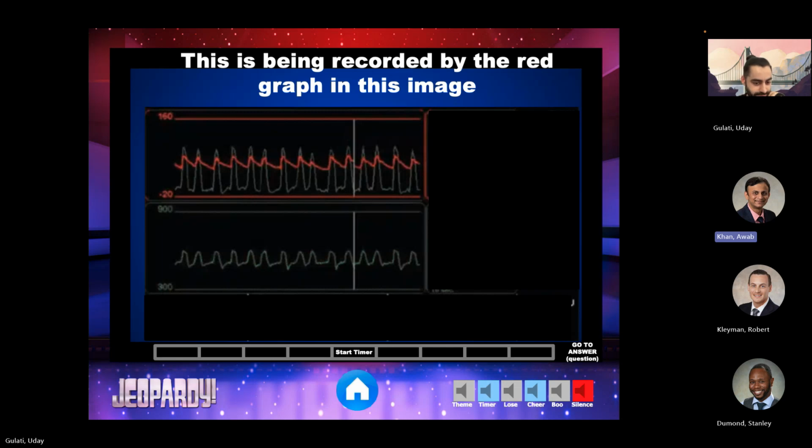So what is the white line indicating? The waveform white line. I guess that would be the ventricle. Yeah, systole. It's measuring the difference between ventricular pressure and aortic pressure, so it's essentially, quote unquote, your stroke volume. So what is the red line indicating?